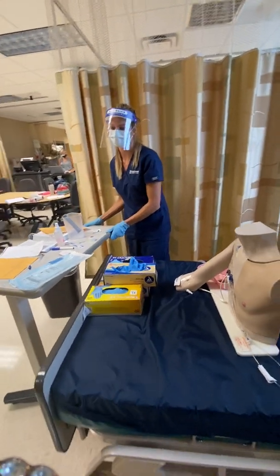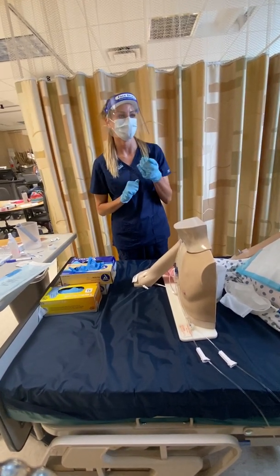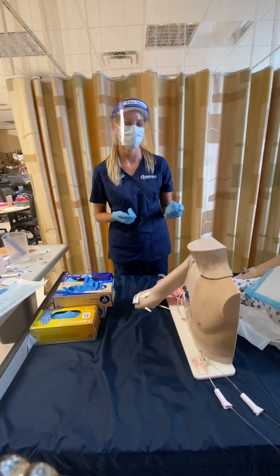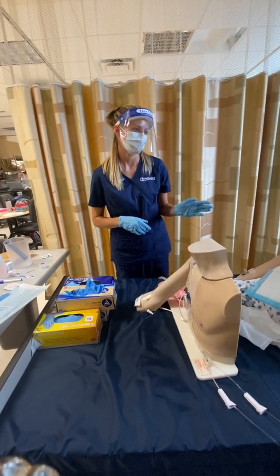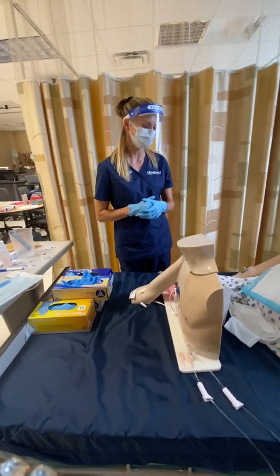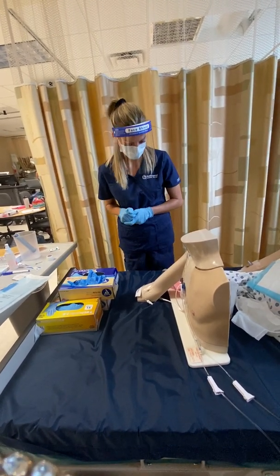So go into the room and document your IV bolus, the amount, the expiration date, all the information for your bolus, and the mils per hour that it's running. Document your Zofran and all of the information with that, the dose, the route, the time given, how your patient reacted to it, and then also document everything for the NG tube, including the measurement that you took of how far it is down, so you can check the placement for that every 4 hours and make sure that it's not moving. And let's see, anything else documenting for NG? Just how your patient reacted and the time that it was inserted, and I think that should be it.